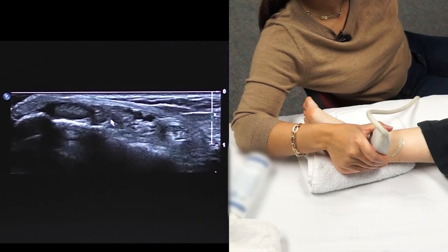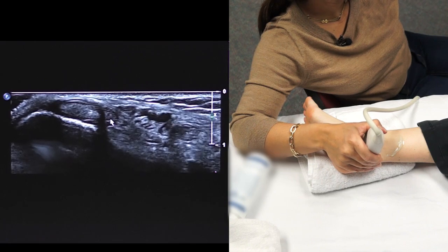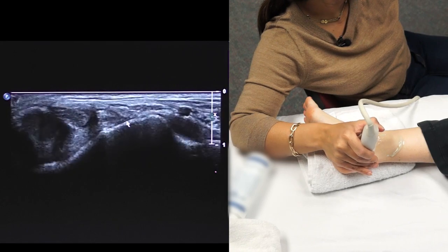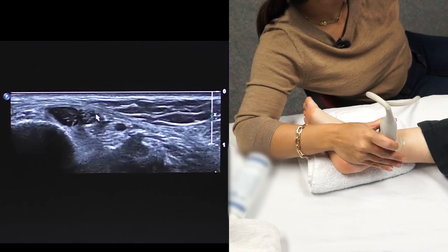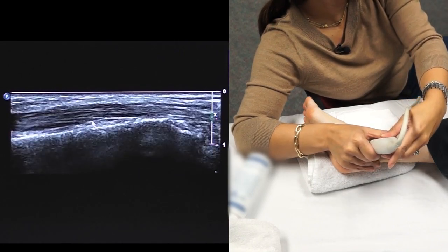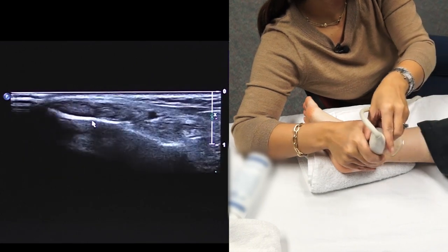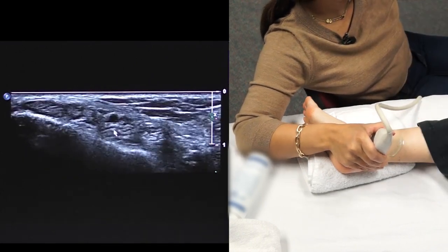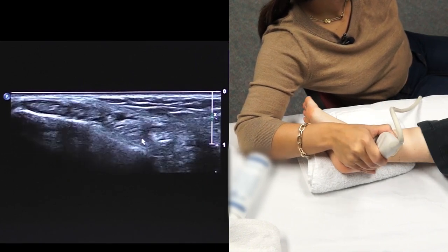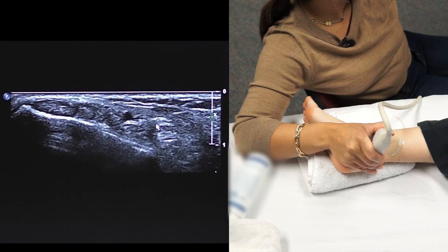It's not as common to see pathology involving this tendon, but if you needed to look for it, this tendon is the next tendon over, next to the posterior tibialis tendon, okay? And again, if you need to scan that tendon, you want to scan it transverse, all the way from cranial to caudal, and also in long axis to look for any abnormal appearance or fluid surrounding the tendon. I'm going to get back to the neurovascular bundle, which is the very nervous in the mnemonic. And for now, look at the flexor hallucis longus tendon, which is H for Harry.